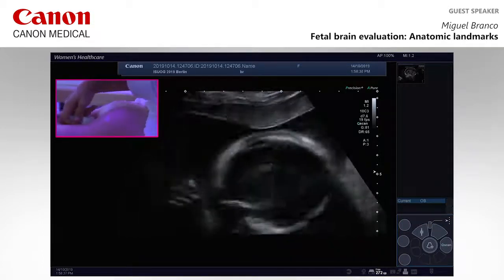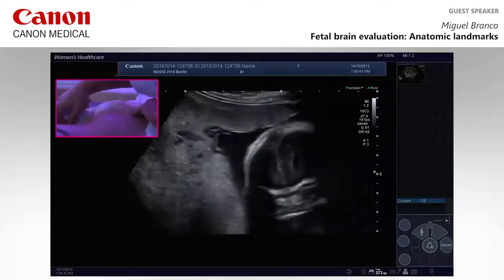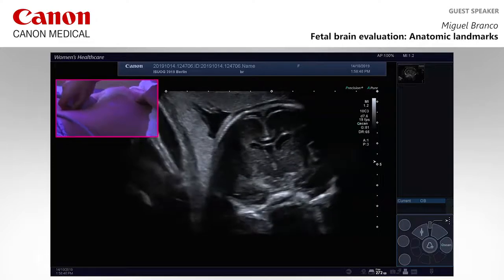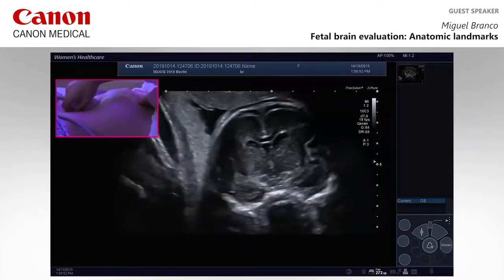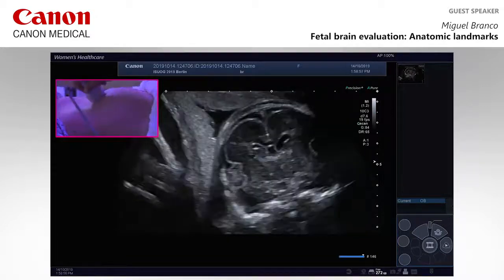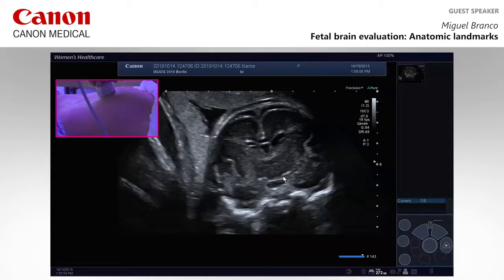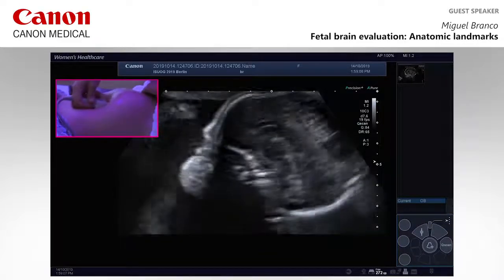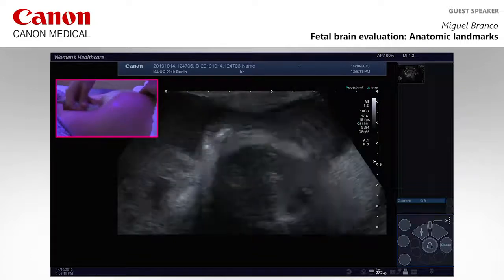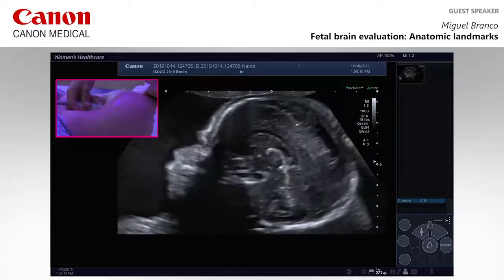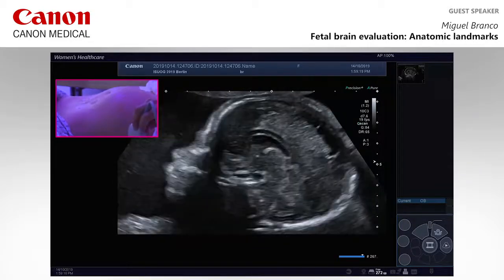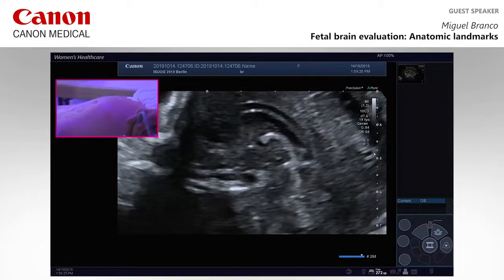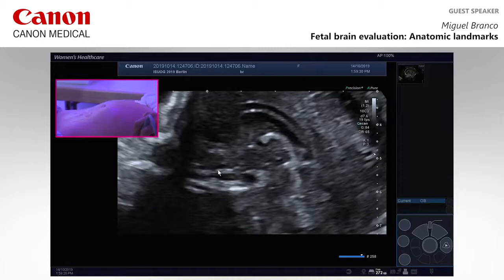Can you show the optic nerves and chiasm? We'll try. It's easier to see in the third trimester, but here it is — between here and here. And here in the sagittal evaluation, the optic nerve.